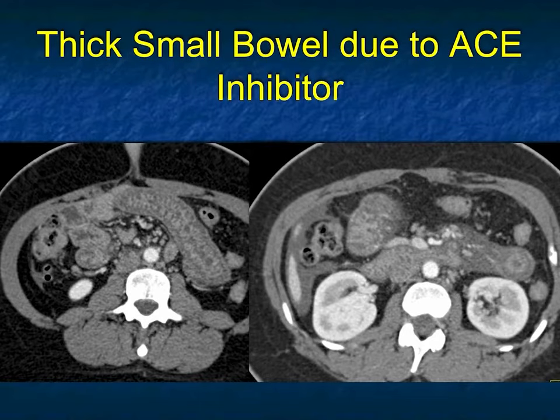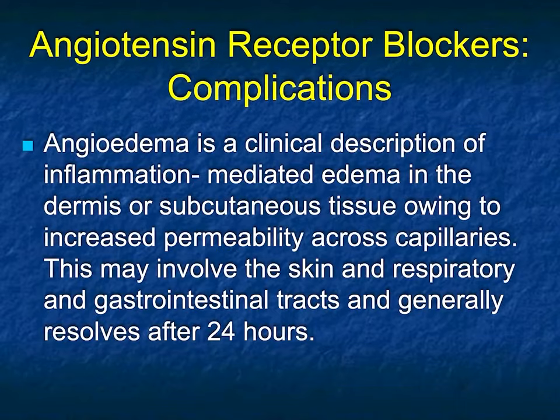Again, ischemia is a consideration, but the vessels look so good, it was not going to be what we were thinking of. And just a couple slides.